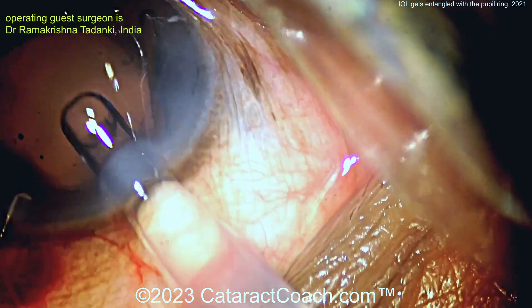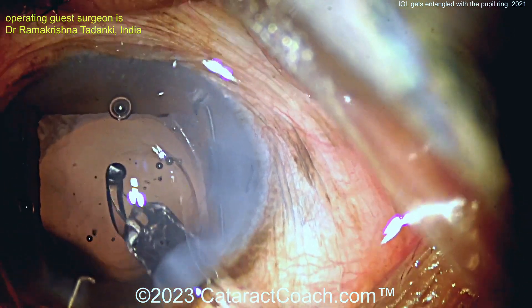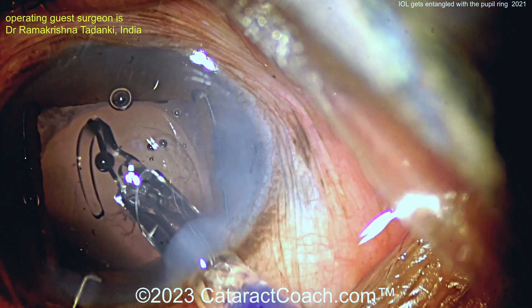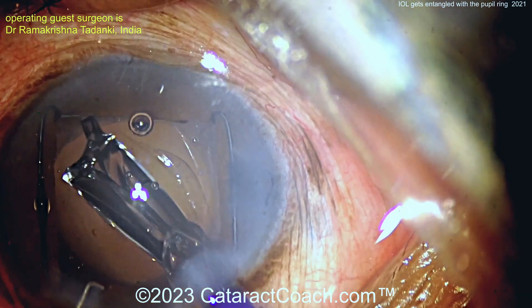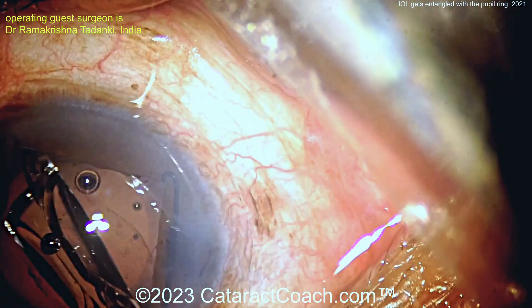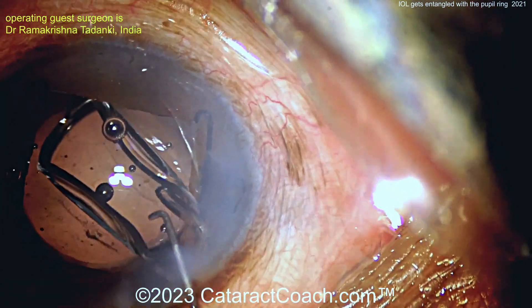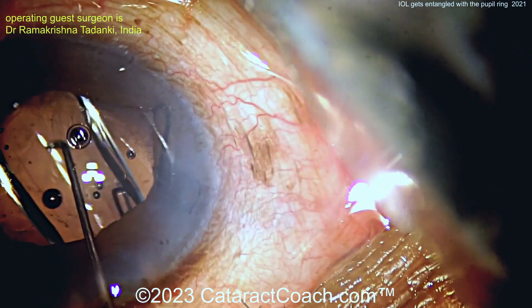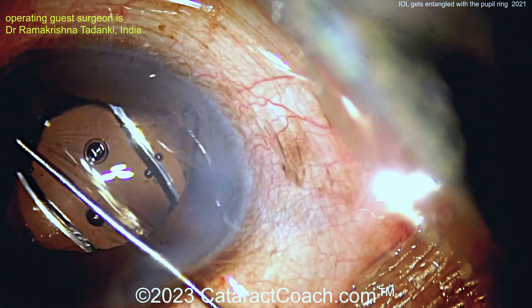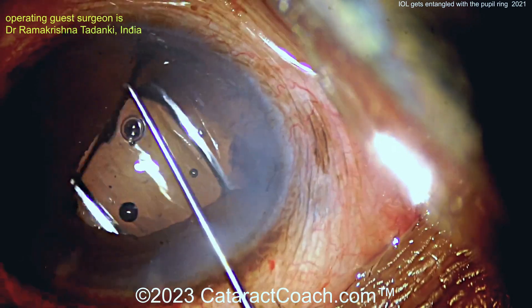Now here comes the lens. Let's see what happens here — why is there an issue? Injecting. There's the leading haptic going in the correct orientation, like the letter 7 or the 7L rule. And then the trailing haptic — get that in the bag. I'd want this in the bag before it starts to open up. But now look — the trailing haptic has disinsertion the ring.